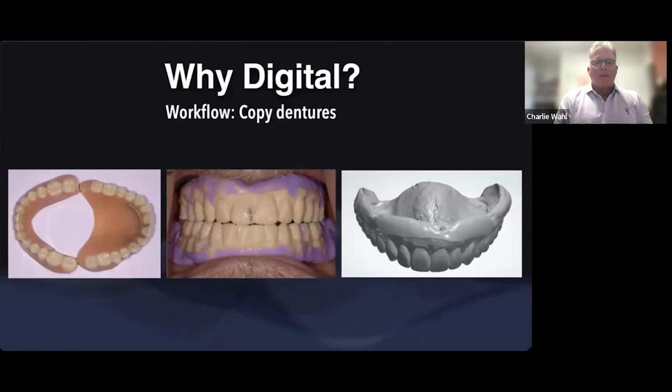I can bimanually manipulate. I can equilibrate this denture, all ways to get myself into the ideal jaw relationship that I'm trying to achieve. And then more importantly, I have a reference point for vertical, and I also have a reference point for tooth position. So all key ingredients that can help me put teeth where I want them.